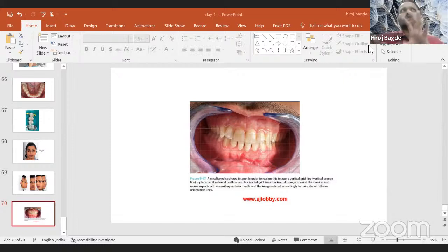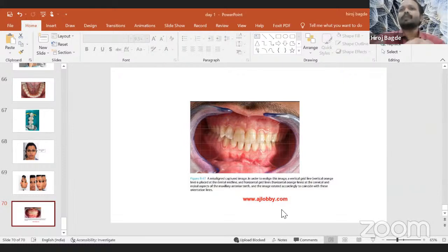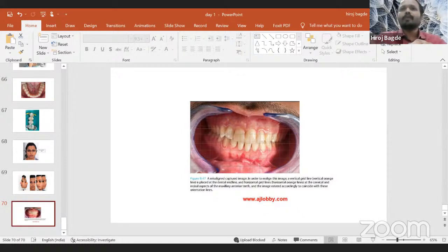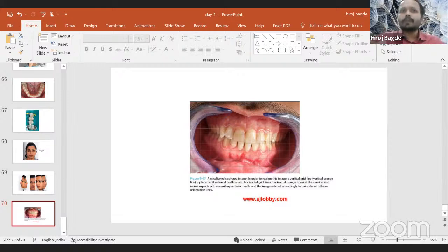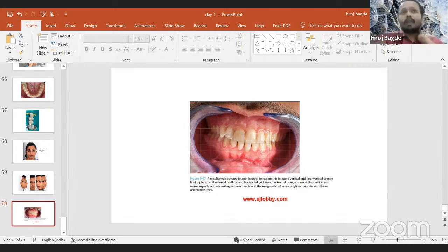This is image processing in a very short time. You can definitely work for at least two or three minutes for basic processing — you need not over-process the image. After this, in post-processing, there is one more software very important for any kind of image processing work. Open with something called IrfanView. IrfanView also has many options — you can change the histogram, adjust color, sharpen, image effects. One very good quality of IrfanView is that you can resize and resample the image. Just click on resize and resample.